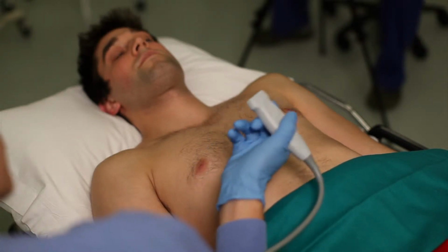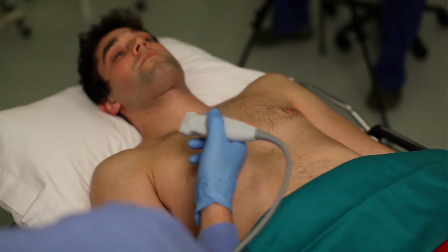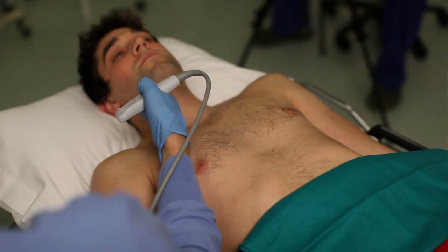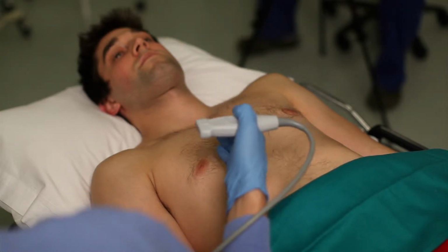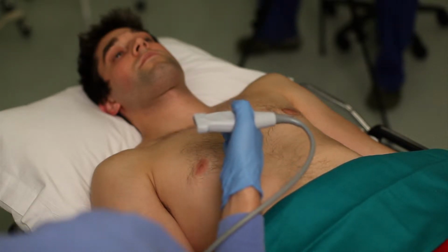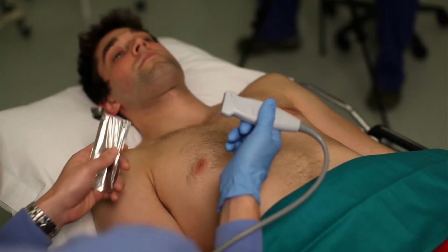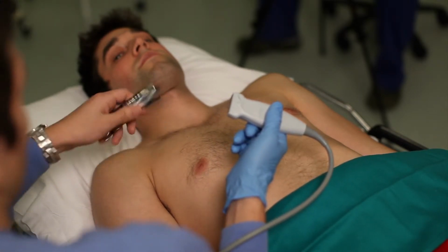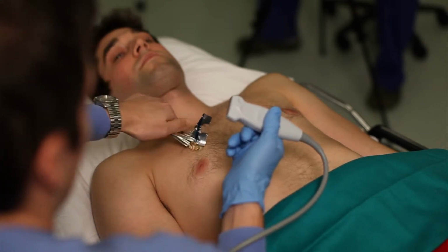So, same principles as before. You will hold this in a pencil grip. You will search the midclavicular line, and in the supine patient, the most superficial portions would be the 3rd to the 5th intercostal space, and gas rises. So that's where we're going to look for pneumothorax first. Sterile gel doesn't have to be sterile. It's what we happen to have. So you can always put more gel on the patient than you can on the probe.